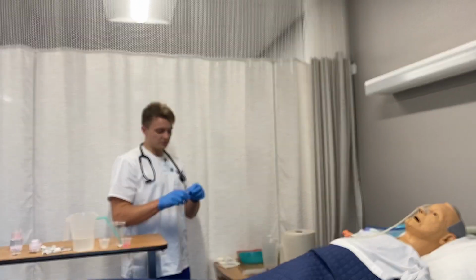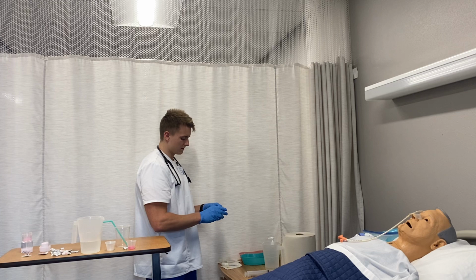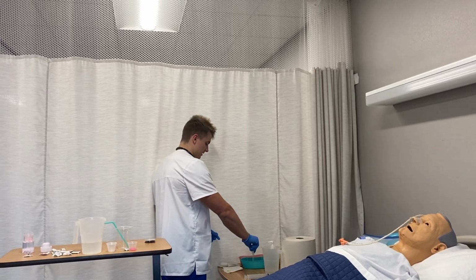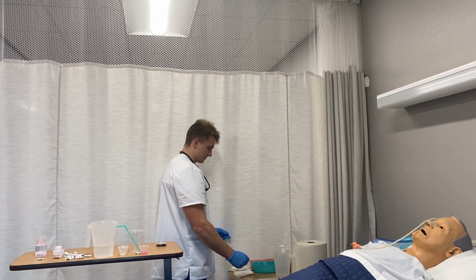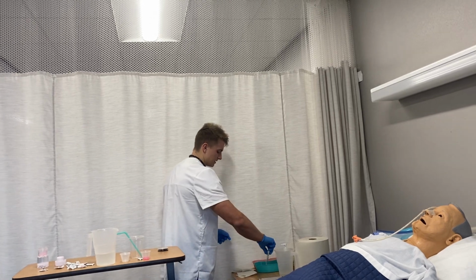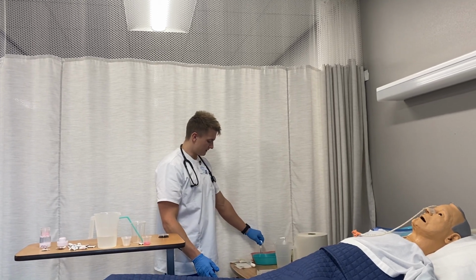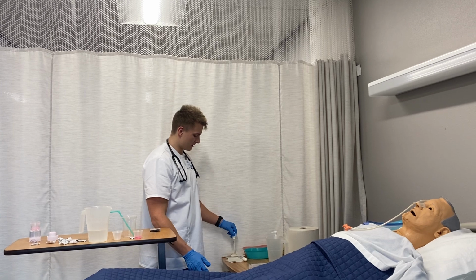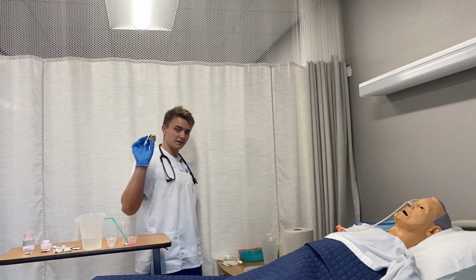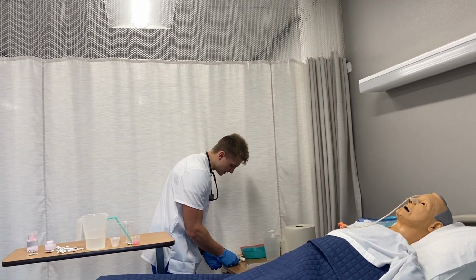And so I'm going to grab two pH strips to demonstrate two different pHs. pH 1, pH 2. And I would take the specimen from the liquid that we had taken out via the tube, and I would place a drop on this paper here, and then I will look at the pH and compare to where the paper is. So this first one is a pH of 8.